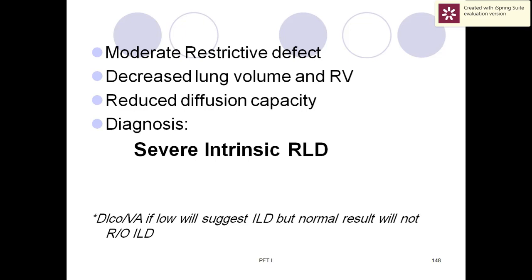So by this I will end my talk. We spoke about spirometric measurement, lung volumes, diffusion capacity, and bronchial airway challenge or challenge test. The four important tests, which are very important in any pulmonary function test lab for measurement and assessment of our patient. Thank you.